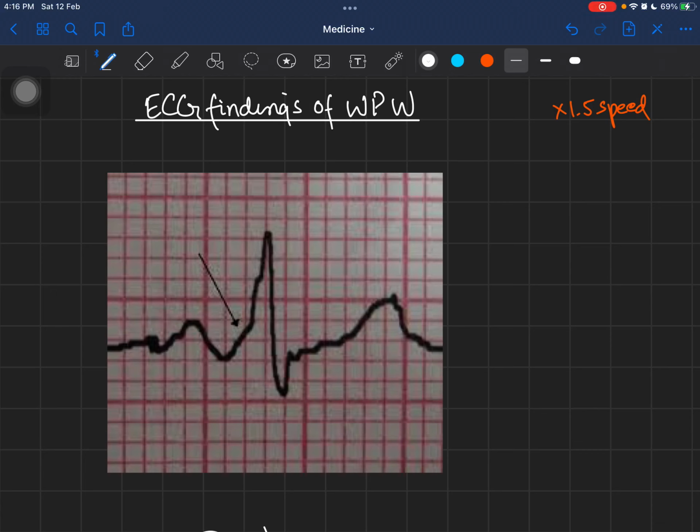In this video, we are going to analyze the ECG findings of WPW syndrome, or Wolff-Parkinson-White syndrome. If you want to save some time, you can watch this video at 1.5x speed. So before trying to make sense of what is in front of your screen right now, let us understand the pathophysiology of this disease.